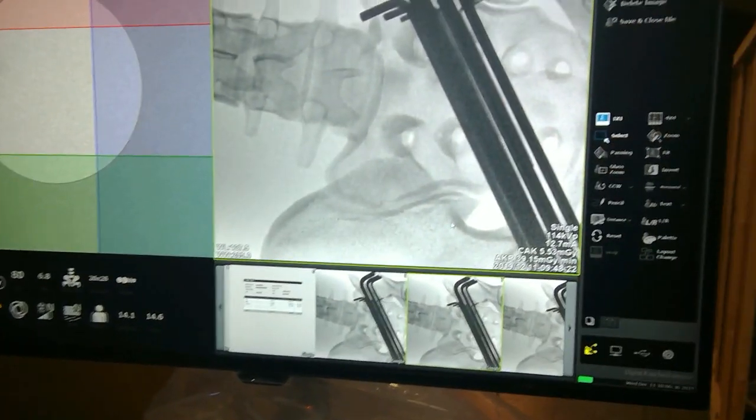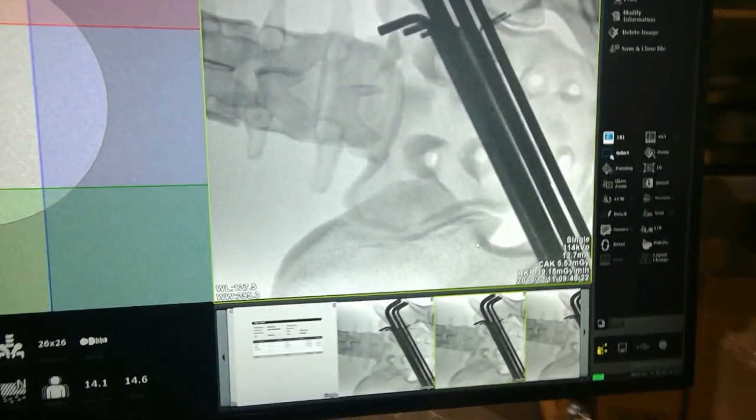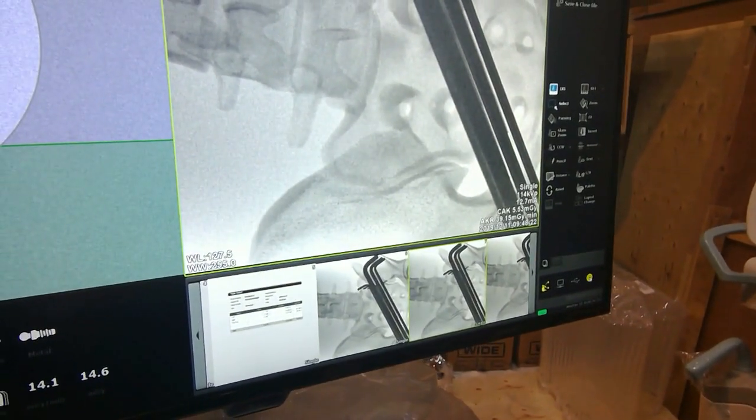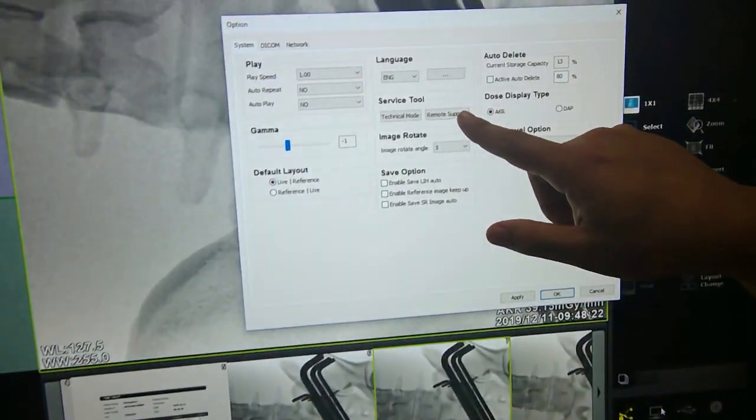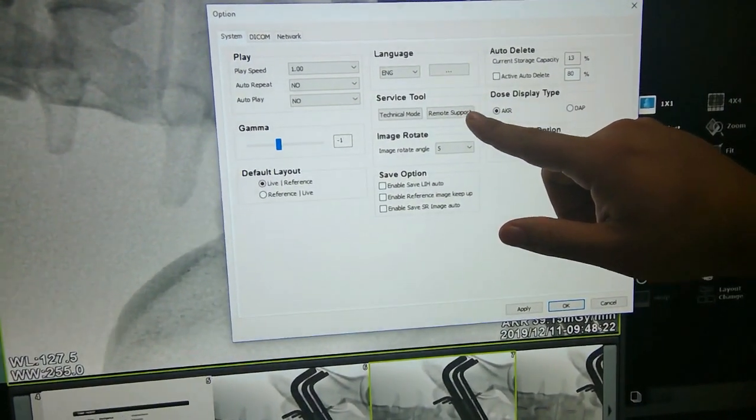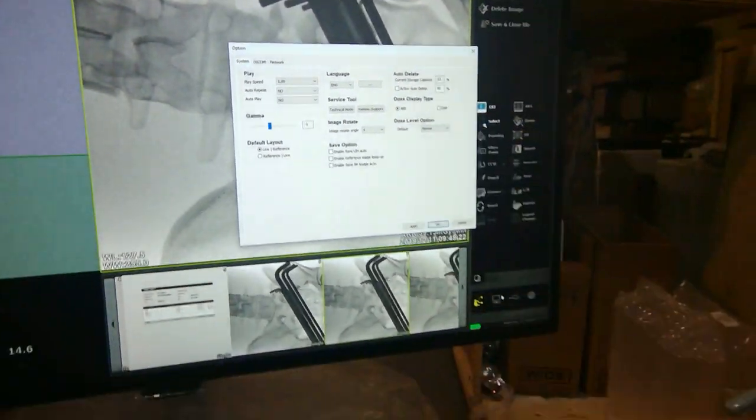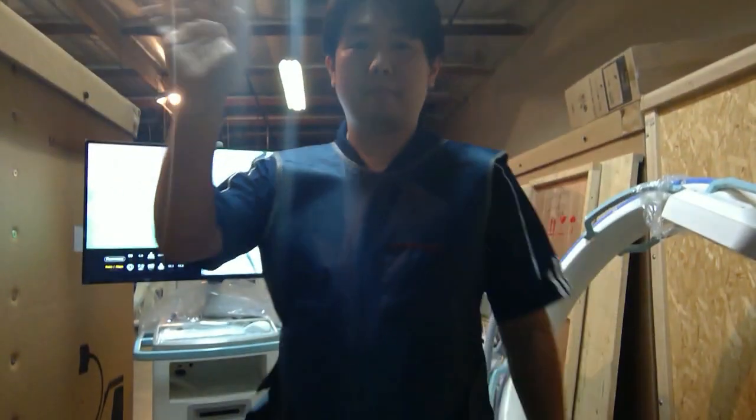Now, one thing that I want to show you on this particular system is it has a remote support button, which you can use for us to literally remotely diagnose and troubleshoot your system without any delay from our office.